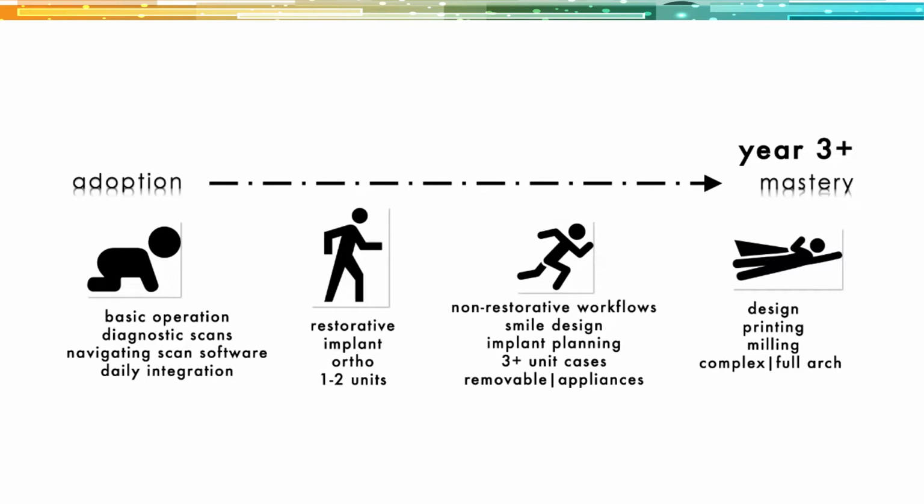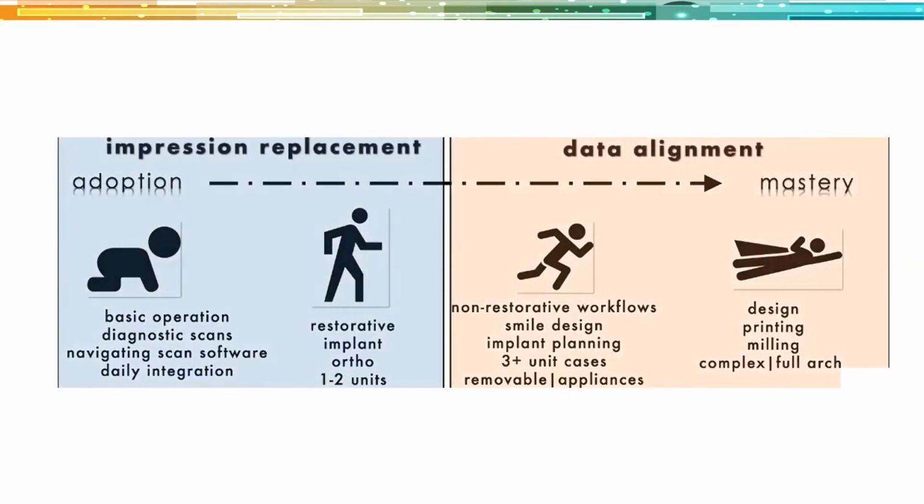And once you really get going with that, then you really get into some of the interesting, kind of exciting things about digital dentistry that we're going to talk about today. Those are non-restorative workflows, smile design, and 3D printing. And it moves really to this expert phase, which can take a couple of years, where you can really manage all of your own design, your own printing, complex full arch cases. And when we look at this crawl, walk, run, fly, the beginning phases are using the scanner more as a replacement for impression material. And the more complex workflows really have a lot to do with data alignment.